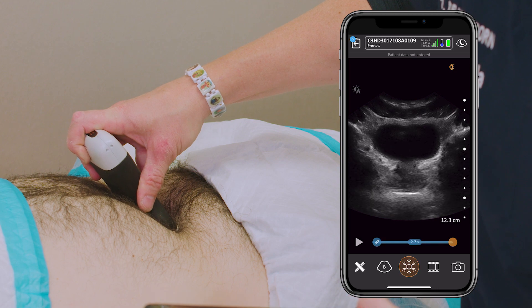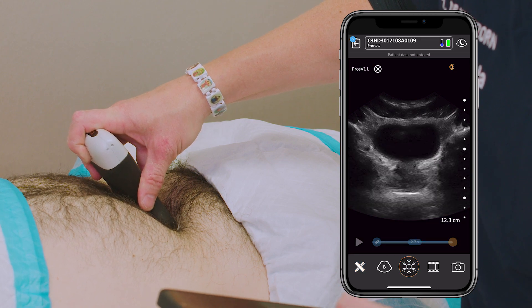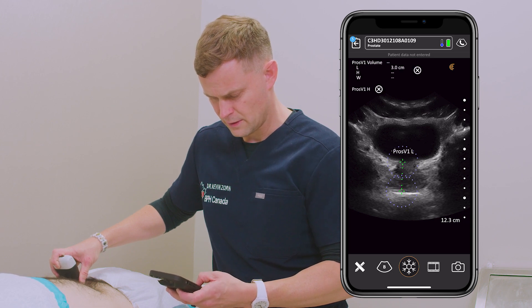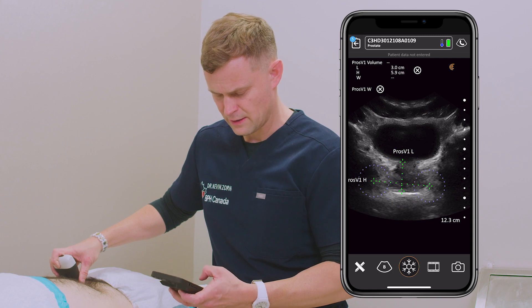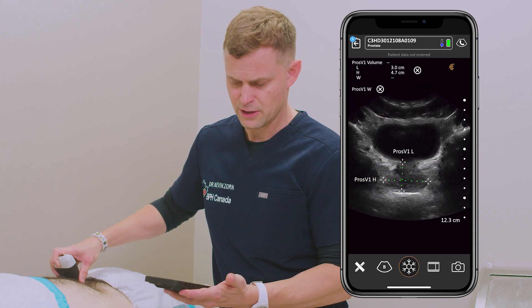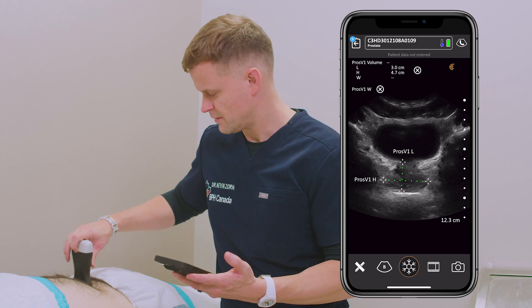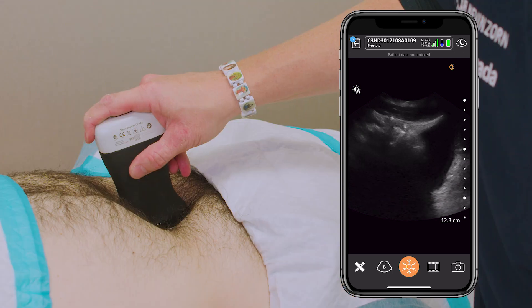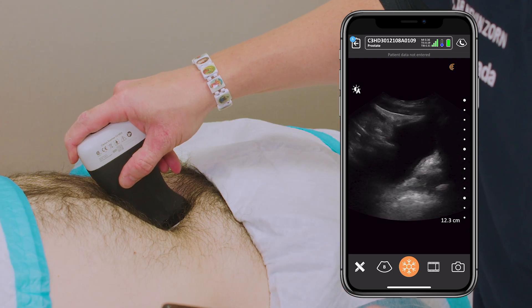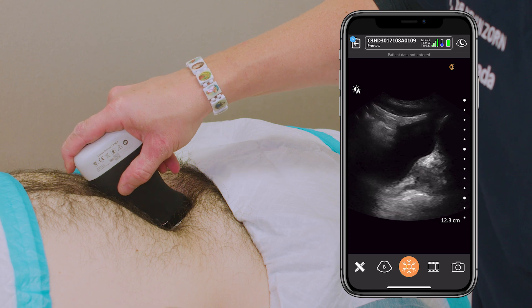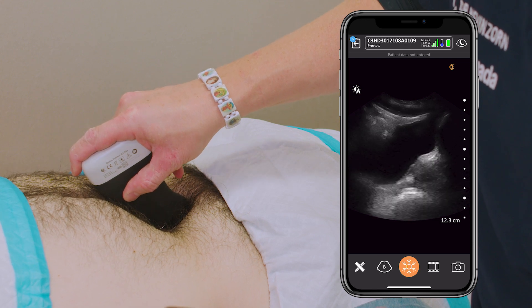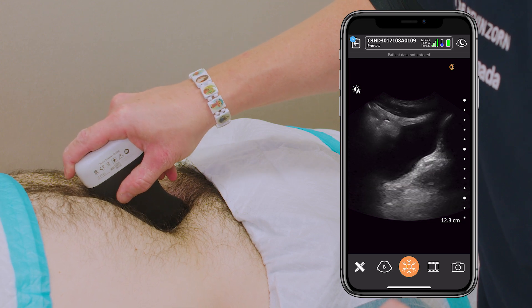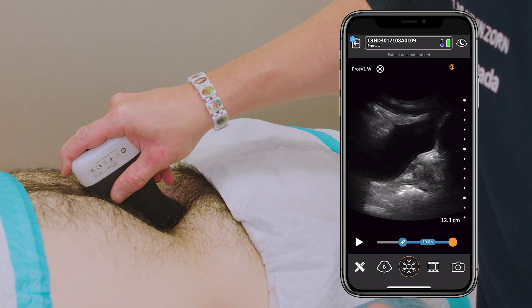Let's go ahead and save that large view and do my prostate volume measures. There's my upper, my lower — scoot that up — and then the same thing for the width. Save that. You can notice I'm doing all of this with my iPhone with my thumb, so this is all readily available, quick at your finger, and rapidly gives you your findings. Same idea — torque down — I'm looking for the seminal vesicles, and here they are, one and two. Take that largest view of the prostate — here we go.